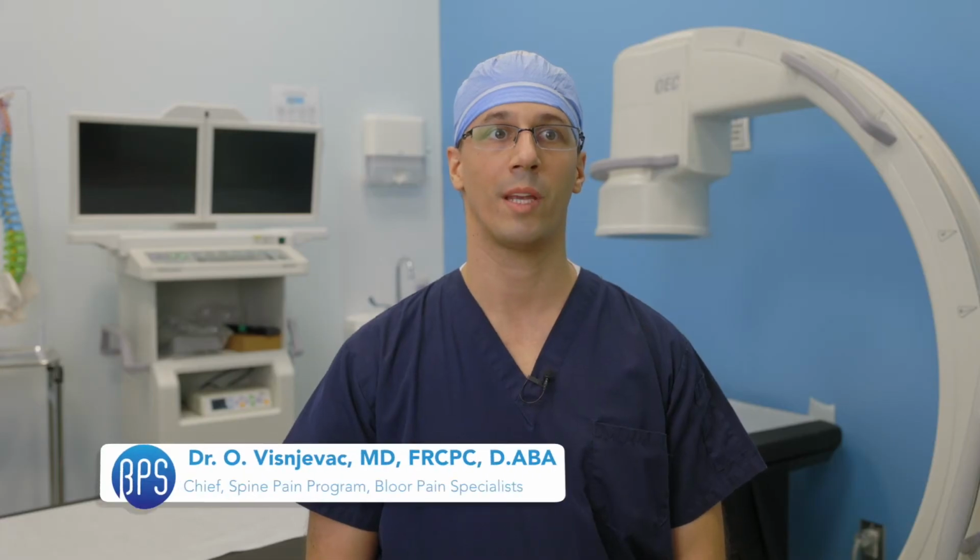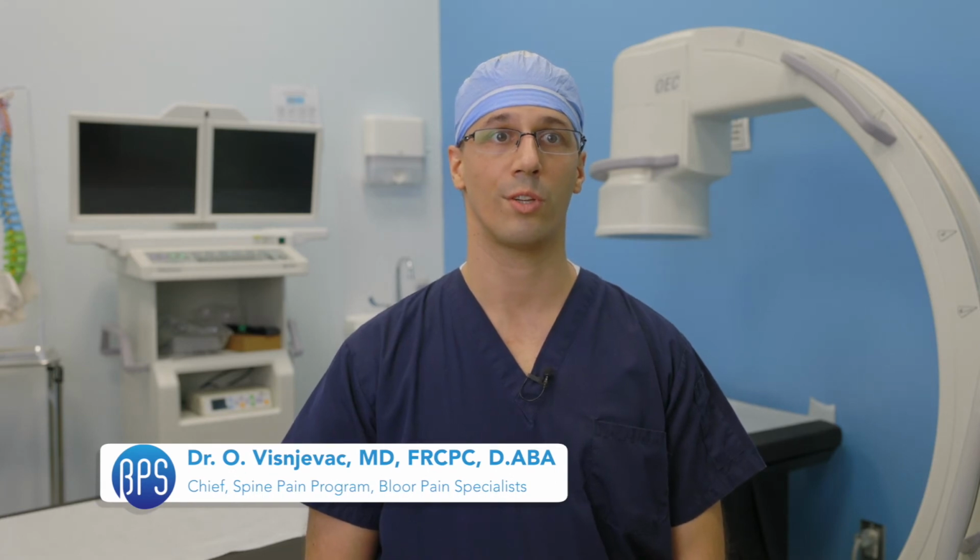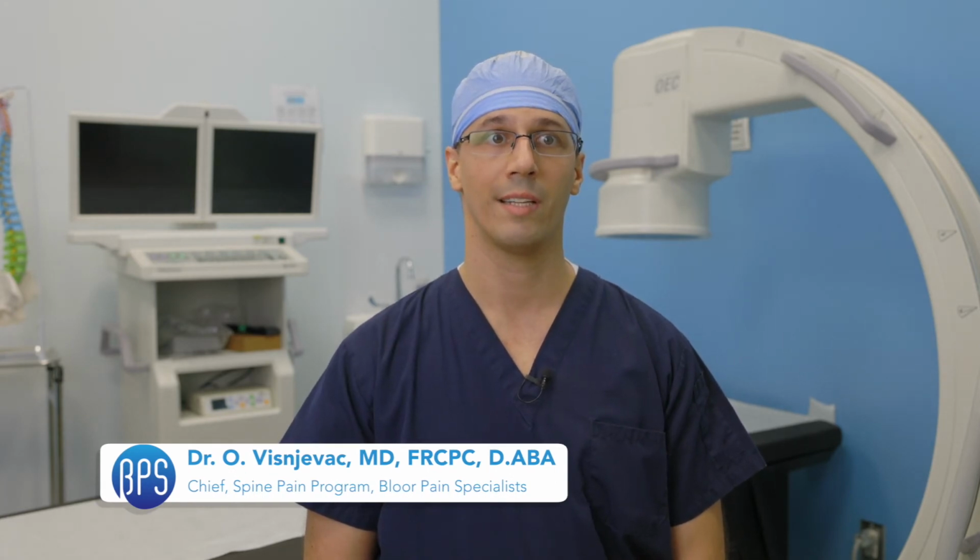For those patients coming in for radiofrequency ablation to treat their arthritic back or neck pain, some of the same concerns about local anesthesia hold true, and you should have a friend or family member take you home. Radiofrequency ablation, or RFA, is a phenomenal technique that can keep people pain-free from their arthritis, unable to feel their painful joints for months and months, and in some cases for years. RFA has a few simple steps.